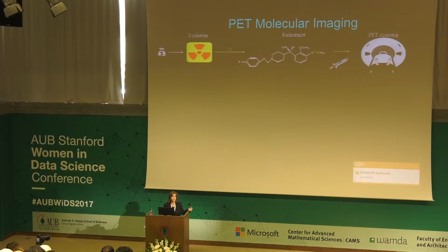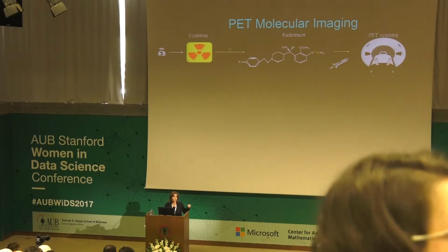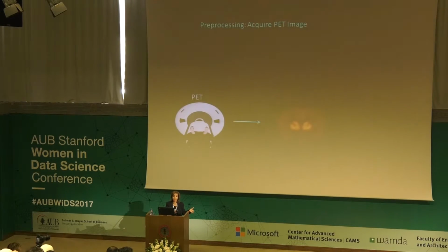When this radiotracer is injected into a subject, which is how we do PET imaging, it will concentrate on the sites in the brain for which it has high selectivity and affinity, and it will give off radioactivity from those sites. By tracing back where the signal is coming from, you form a map of where the radioactivity is distributed in the brain. This is where the targets are that you're looking at, as you produce an image like this.